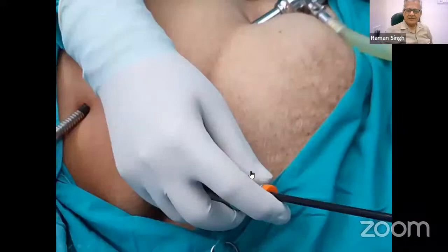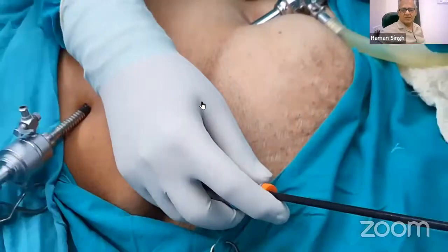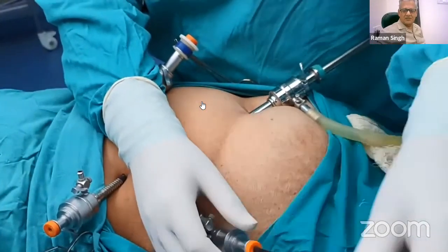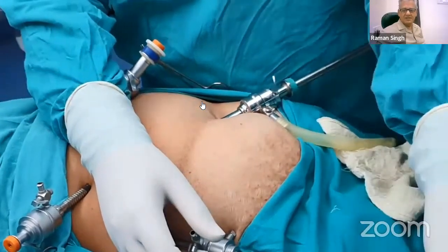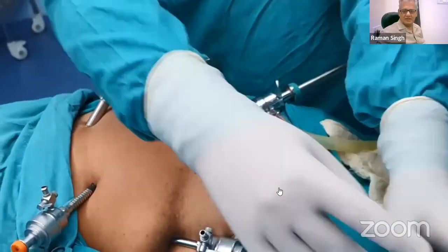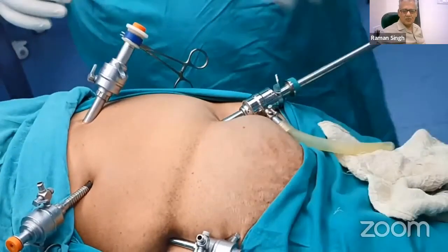Now you can see, the second surgery is done by me, and you will see there is not much difference between the two. So we should always try that our students learn properly and perform laparoscopic surgery safely and carefully. So here all four ports are there.